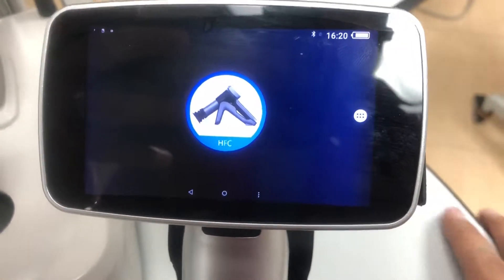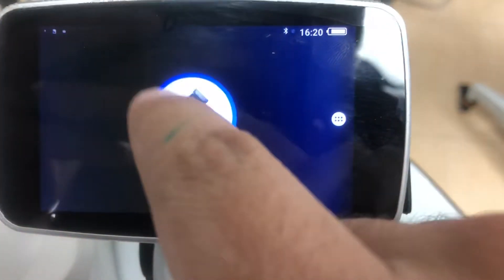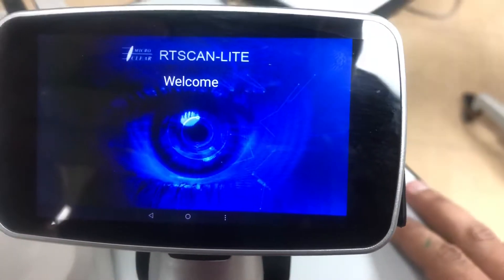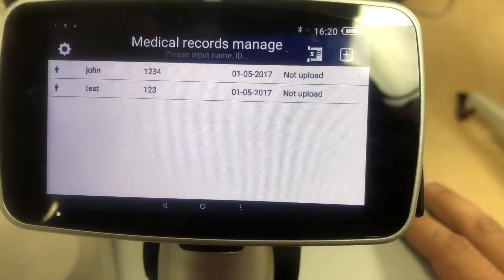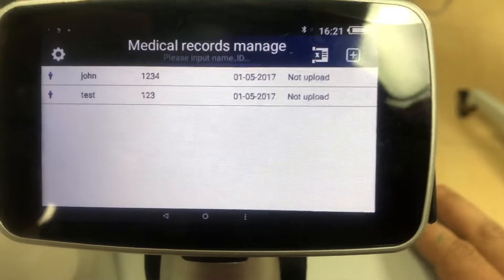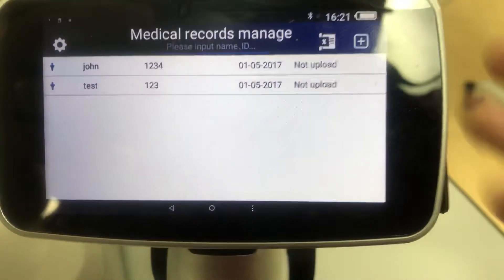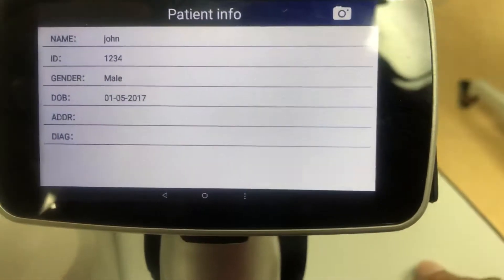Here we have the unit turned on. We're just going to simply click on the application. Once the application starts up, you'll see we have some patients. You can simply select on their folder once you have your patient.